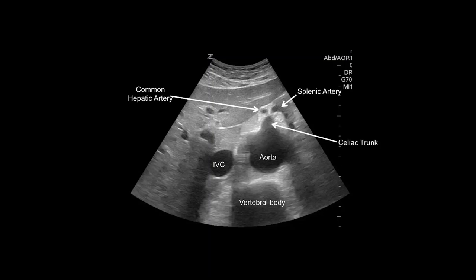The two branches arising from the trunk are the common hepatic artery and the splenic artery. Follow the proximal aorta superior and inferior in transverse orientation until you visualize the celiac trunk and its branches. Additionally, notice the relationship of the aorta to the spine and IVC.